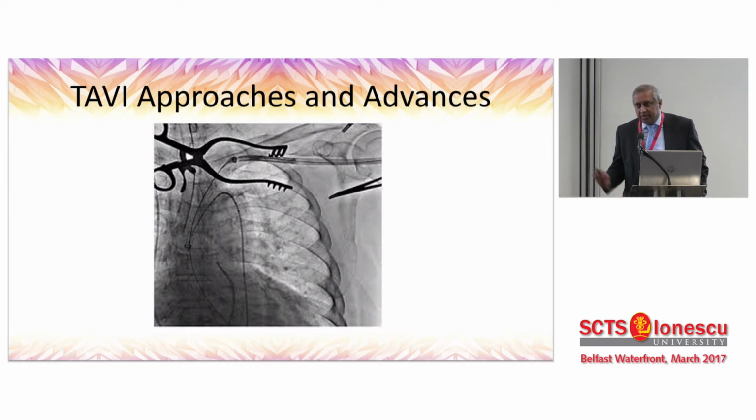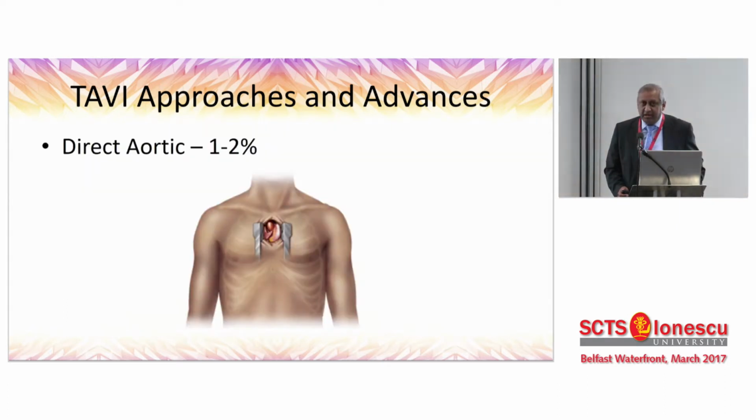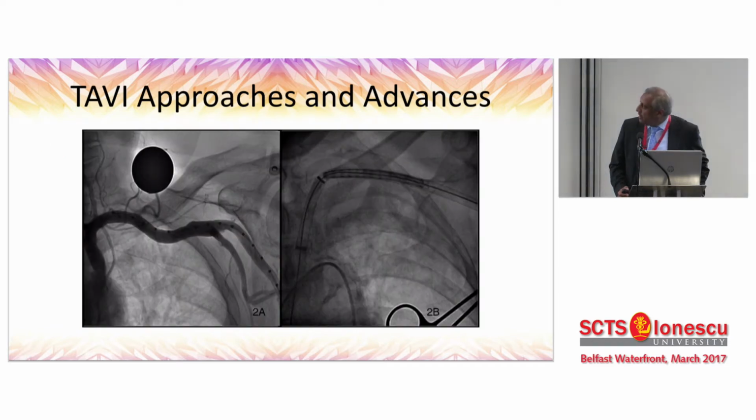What is great when you're doing TAVI and subclavian access is you have a hybrid setup. So you can give some contrast down the arch, and you know exactly where the artery is even before you start cutting on the outside, and you can just go straight down onto it. And then once you've got the device in, the delivery is fairly straightforward.